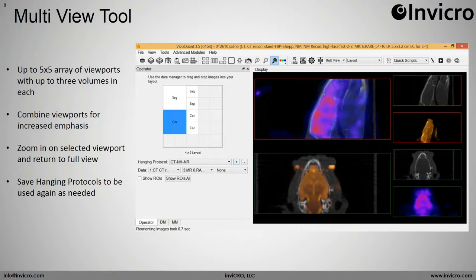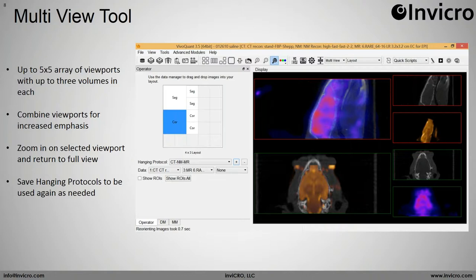Now in 3.5, you can combine viewports, zoom in on selected viewports, and then return to the full view. We've also added the ability to save hanging protocols — for instance, the layout on screen can be saved and pulled up exactly as you see it, which is great for scripting and storing images in batch. Additionally, we've added more operators to the multi-view: the filtering tool, the distance and annotation tool, the arithmetic tool, and the modeling tool, all without having to leave the multi-view. This makes the tool much more powerful for working with and analyzing data.